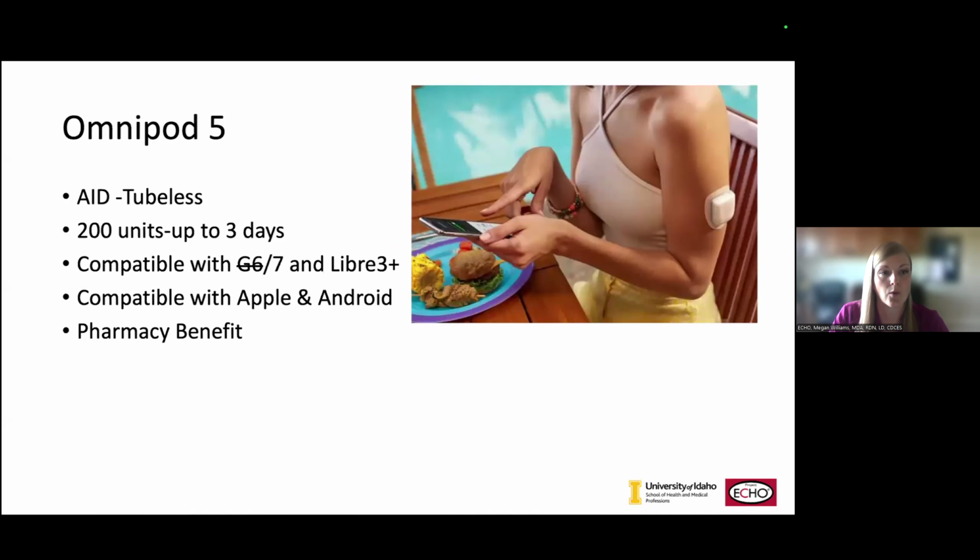So we at Family Health Services right now primarily use Omnipod 5. I would like to point out that all the different pumping systems have different algorithms that they use. And that is something that's undervalued. Most people are looking for tubeless or this or that or the other. And truly, the algorithm is what drives how effective it can be at managing their blood sugars. I am not naive enough to say that the Omnipod 5 has the best algorithm.